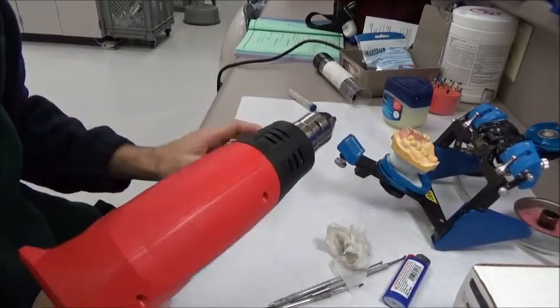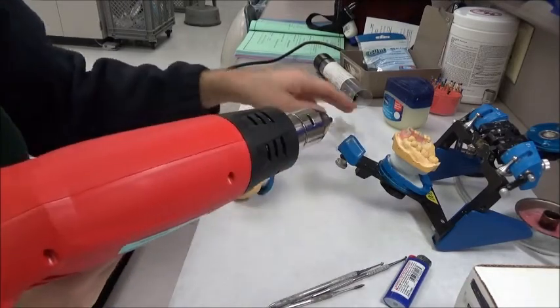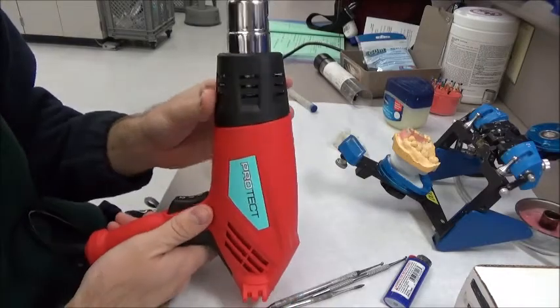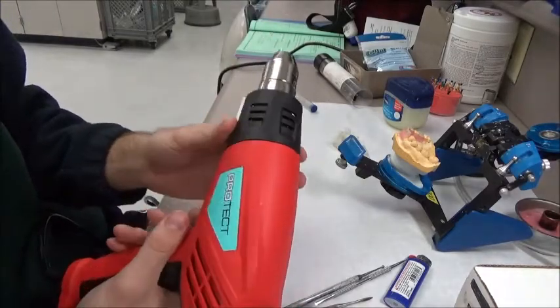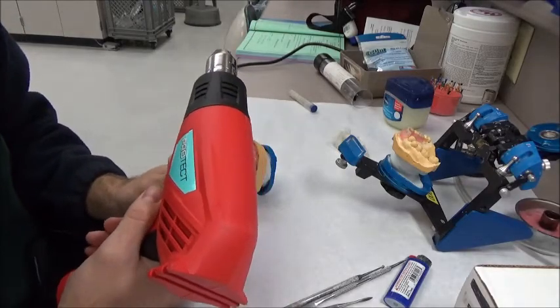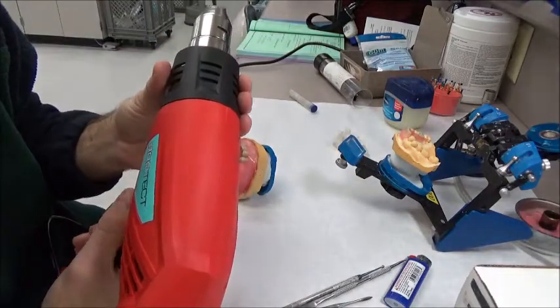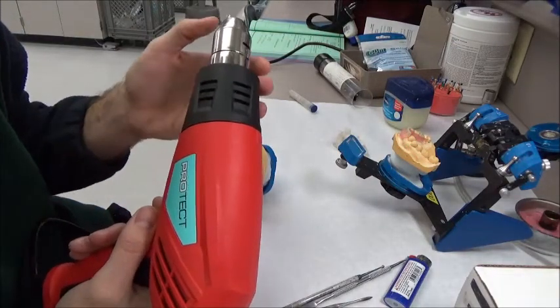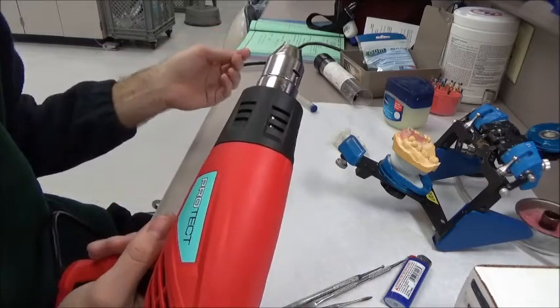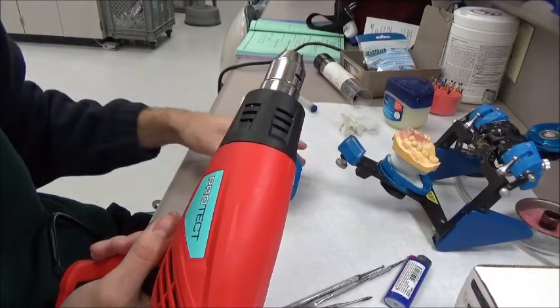Alright, John here. Just wanted to shoot a quick video of something that I stumbled upon on the interwebs. It's kind of big and scary looking, but it's a heat gun. I looked for dental-specific videos, but I couldn't really find much except to say that it's used for heating up plastic suck-down thermoplastic trays. But I thought I'd give it a whirl and see how it worked for other materials as well.